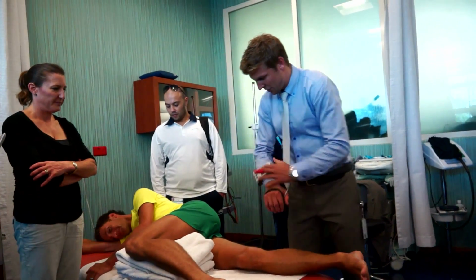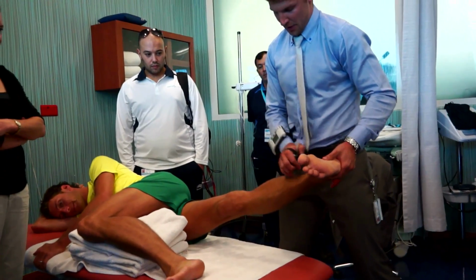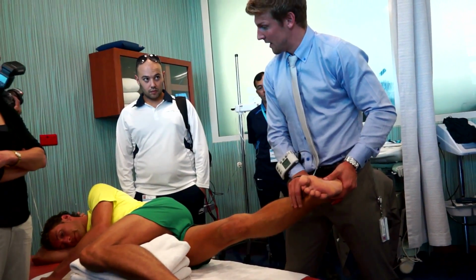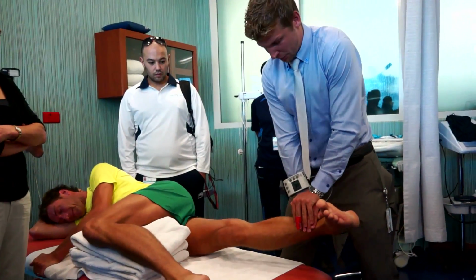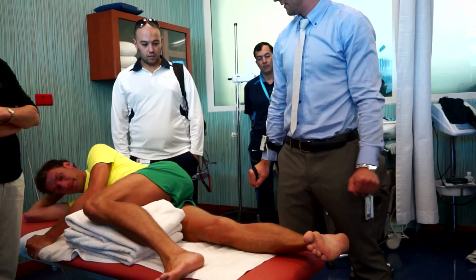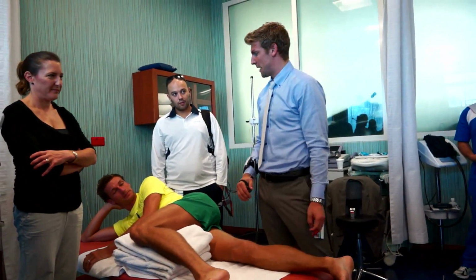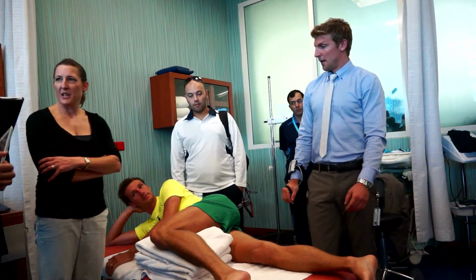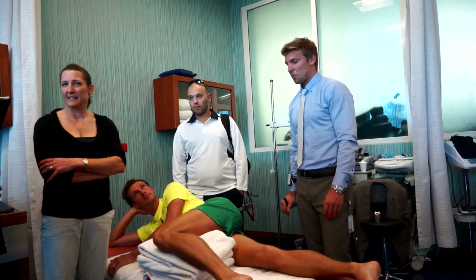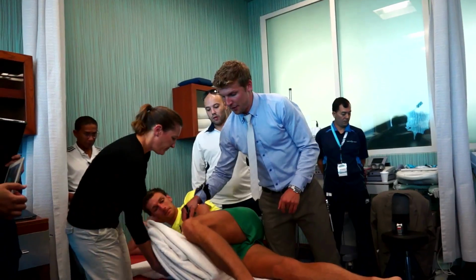You ready? See what you can get. Straight leg. Up here. Get them all the way up. You ready? And go ahead. Push, push, push, push. There you go. So 3 seconds, and then you start with the eccentric, and he'll reach his maximum measure in the eccentric. Great. Any questions, anyone?